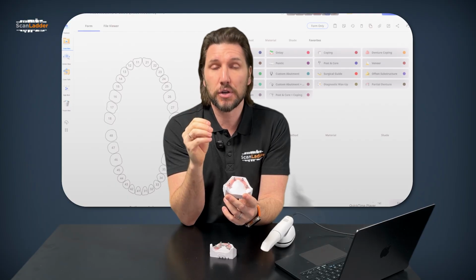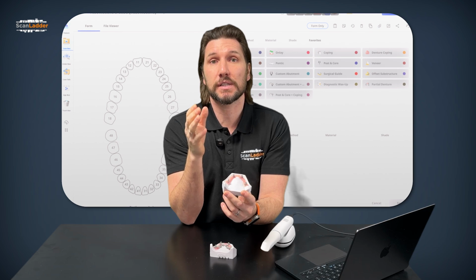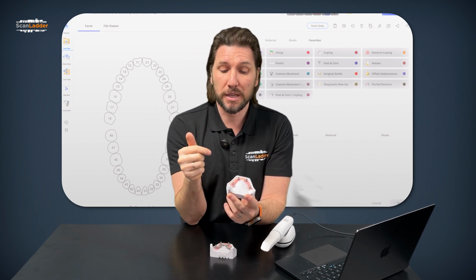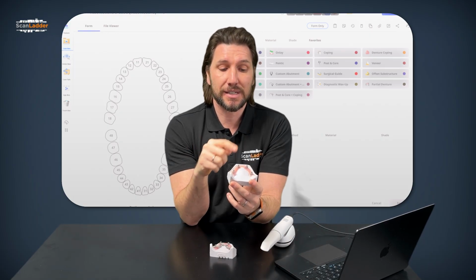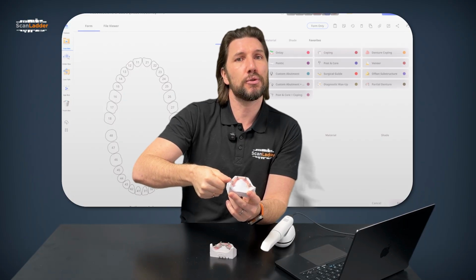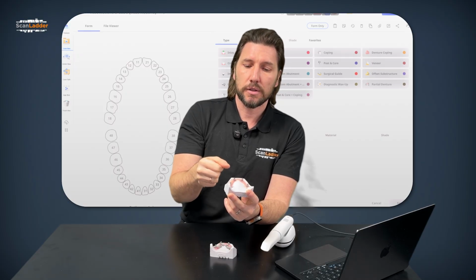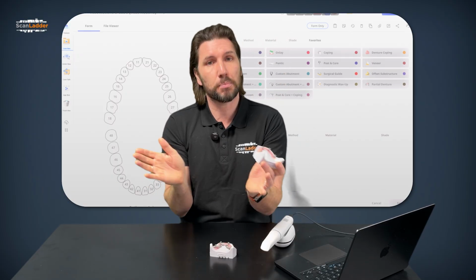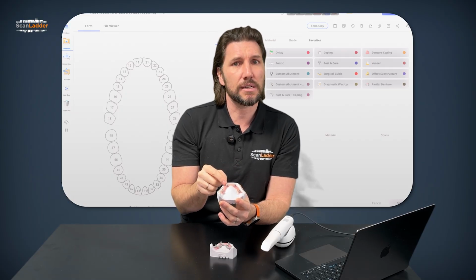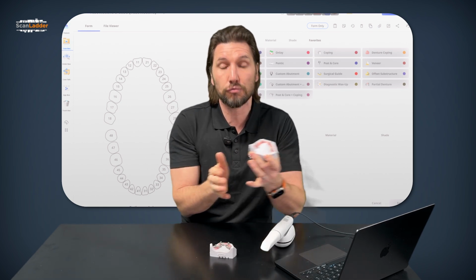Why? Well, one of the reasons I designed it like this was because of the original versions of cylinders that we would use to scan multi-units. One of the biggest problems a lot of people would have was that if we were scanning and had just the same cylinder on each of the different sites, and I'm sure many of you will have seen this, you start to scan, you move across, you get the other cylinder, and the scanner gets confused. Why does it get confused? Well, it starts scanning and goes off on a tangent, you get duplication. It's because the scanner doesn't see the difference between the 2 cylinders. So it sees them and goes, that's the same one and I'm already here. So then it starts adding data in the wrong place.